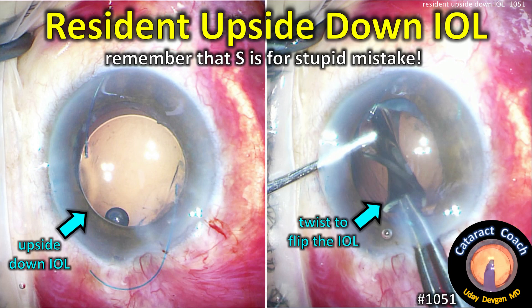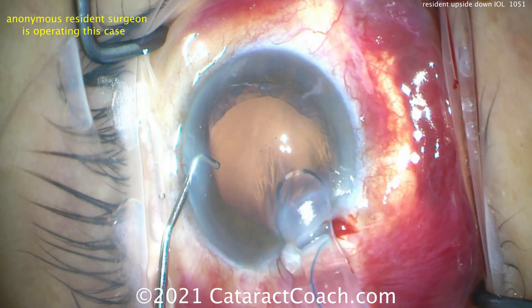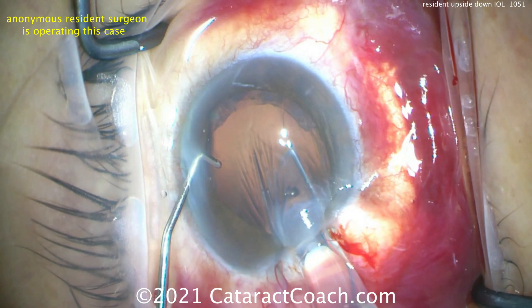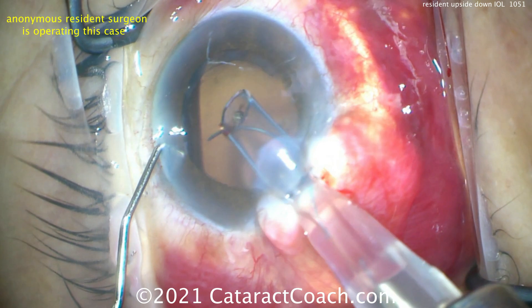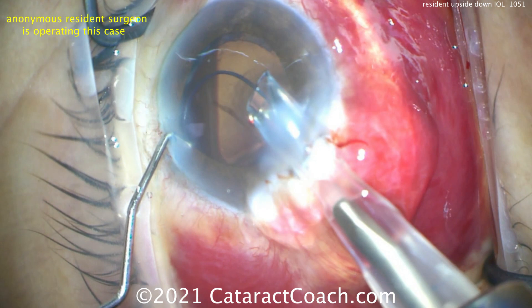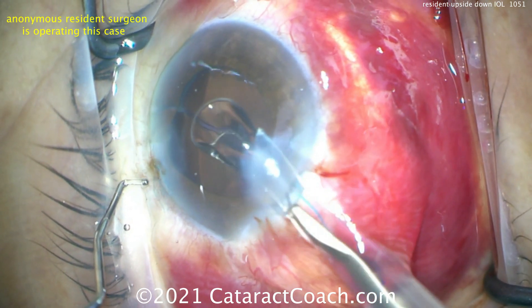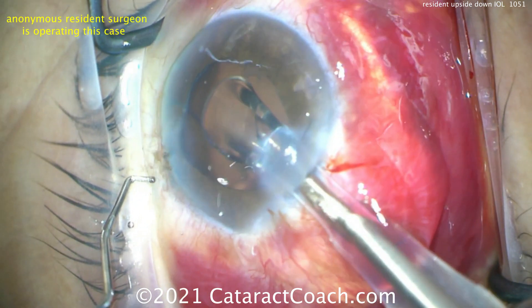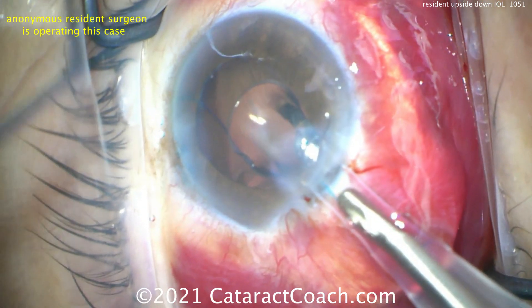cataractcoach.com — a resident case with an upside-down IOL. Remember: S is for stupid mistake. This is a good resident; the issue is simply not being aware. There's a three-piece lens the resident loaded, and already you can see it's going in the wrong way — the injector is upside down. That leading haptic goes in and it looks like it's in a reasonable seven configuration, but then it just flips as the optic comes out.